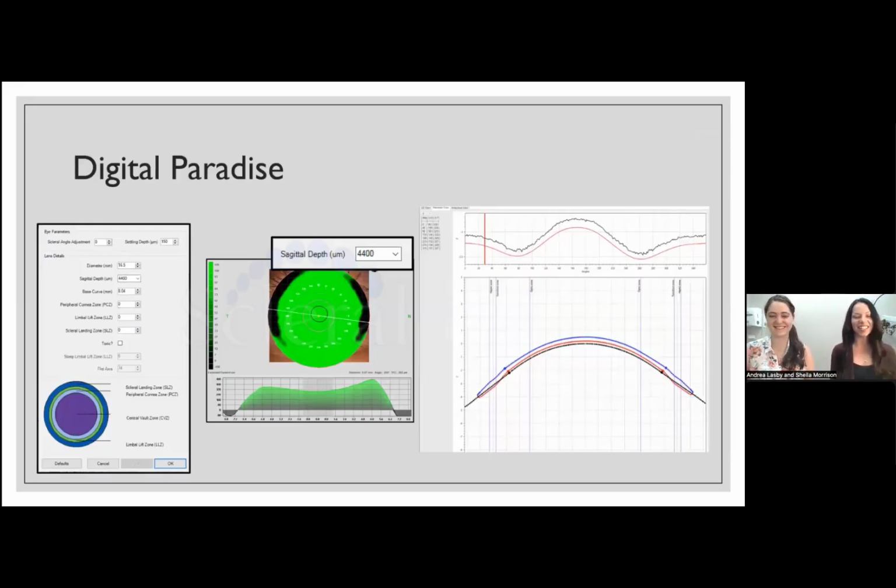And I love things like this because the manufacturers have come so far in creating these beautiful interfaces. They're very interactive. These are just two examples, but there are now quite a few different manufacturers out there that are using things like this to allow practitioners who really kind of are control freaks about their contact lens designing to have full control and get in there and really make those changes that they can see. We still use consultants a lot of the time. I know myself when it gets really crazy busy in the clinic, which is almost always, to do some of that work for you. So you can take it as far as you want. We can have them make a lens almost from start to finish, we can get in there and design it ourselves, or we can do something in between, depending on how much time you have and what your experience level is. And so that's where tech can be really, really helpful.